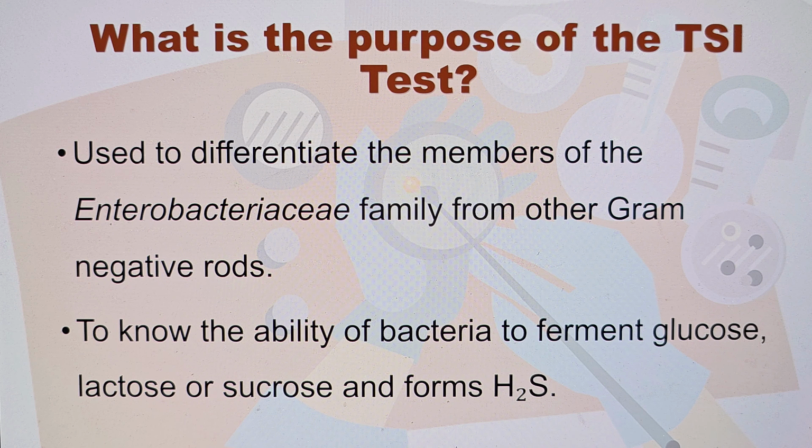What is the purpose of the TSI test? First, it is used to differentiate the members of the Enterobacteriaceae family from other gram-negative rods. Second, to know the ability of bacteria to ferment glucose, lactose or sucrose and form H2S.